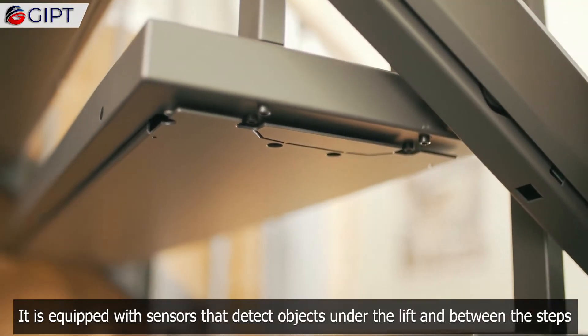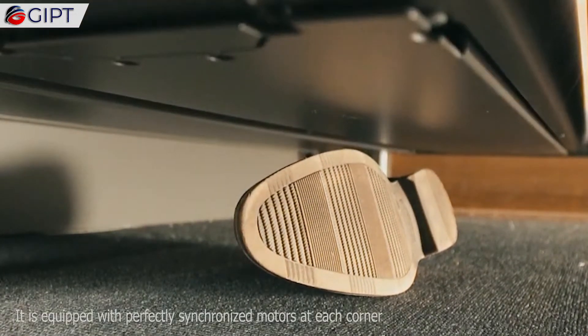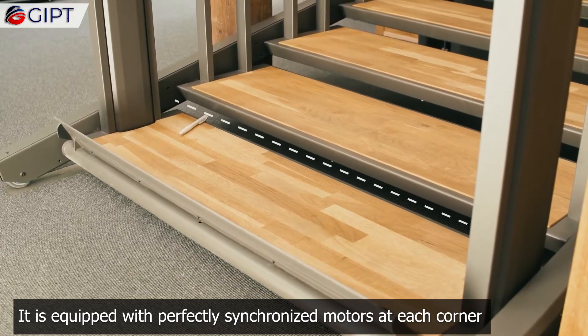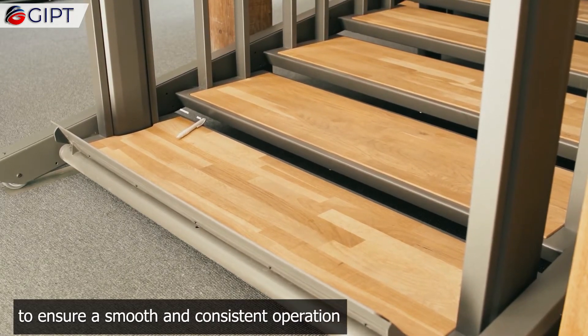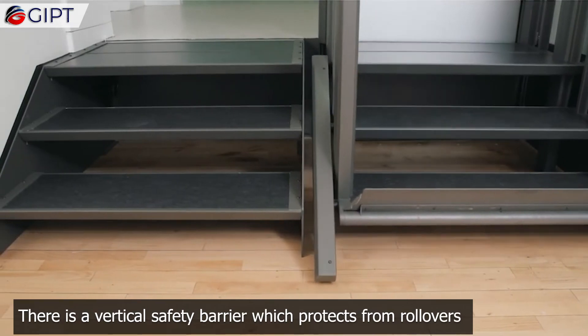It is equipped with sensors that detect objects under the lift and between the steps. It is equipped with perfectly synchronized motors at each corner to ensure a smooth and consistent operation. There is a vertical safety barrier which protects from rollovers.